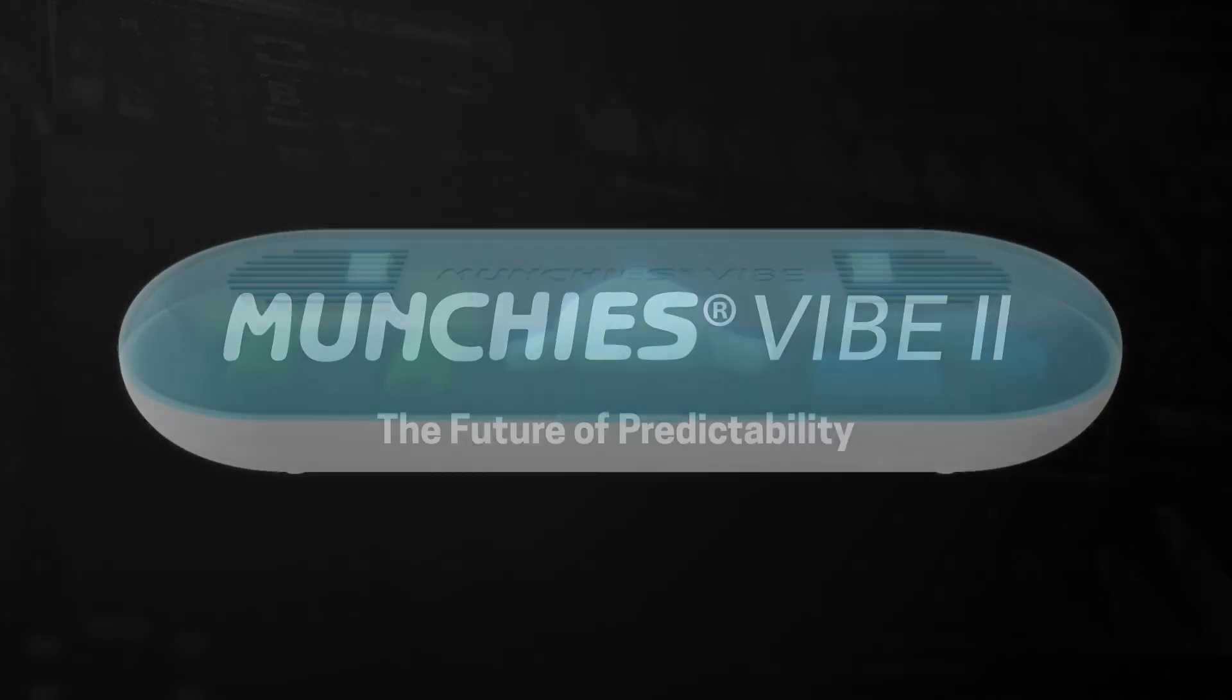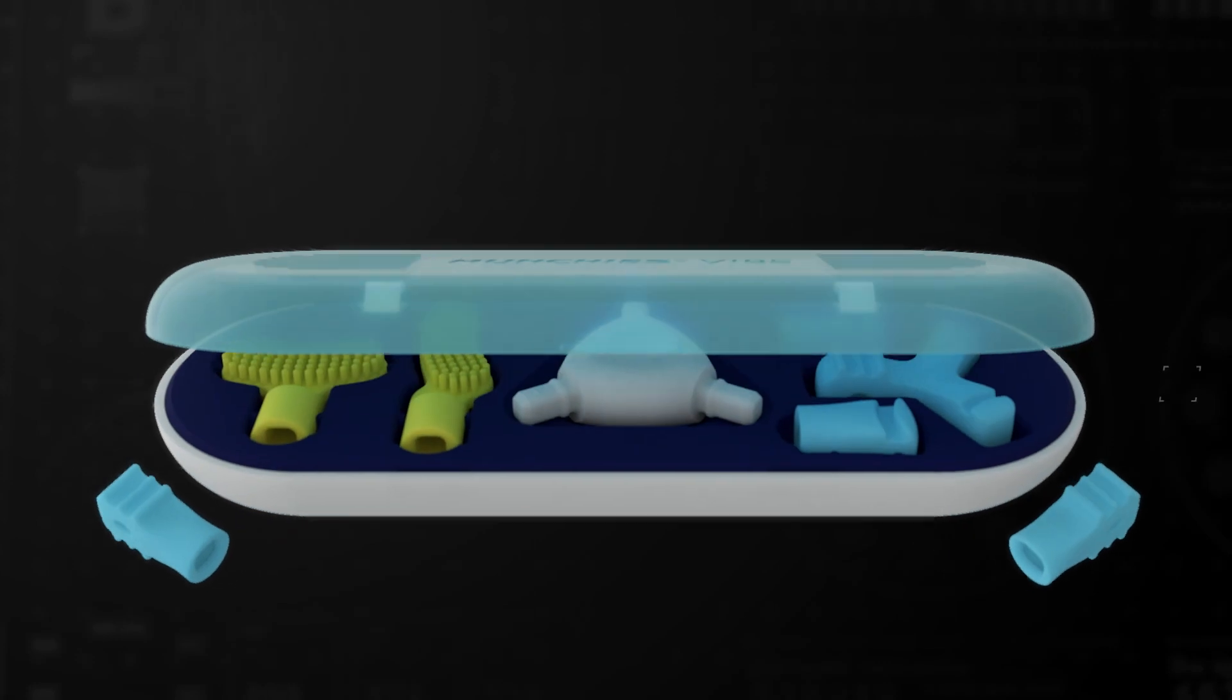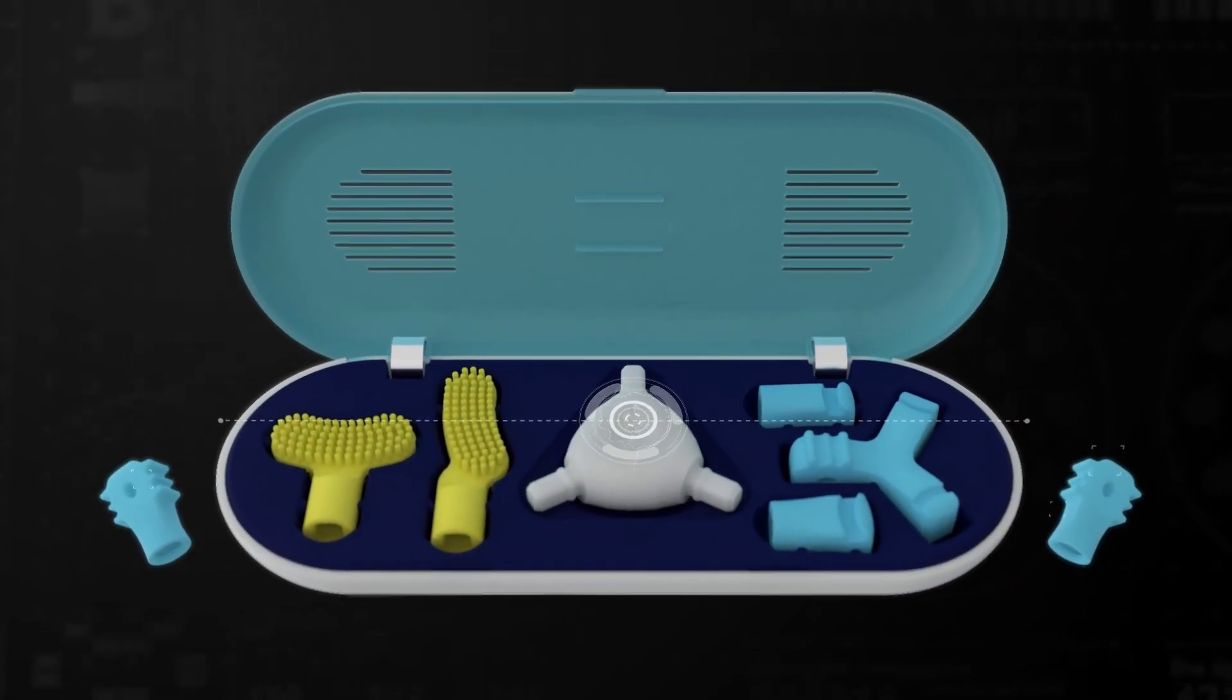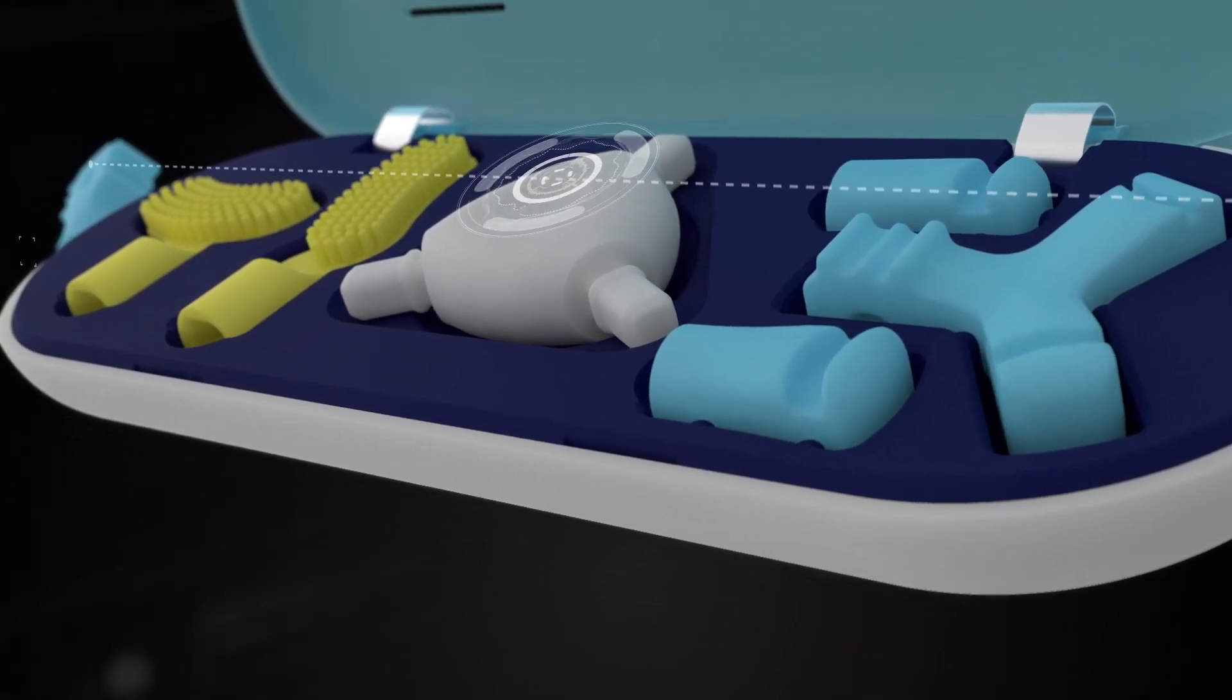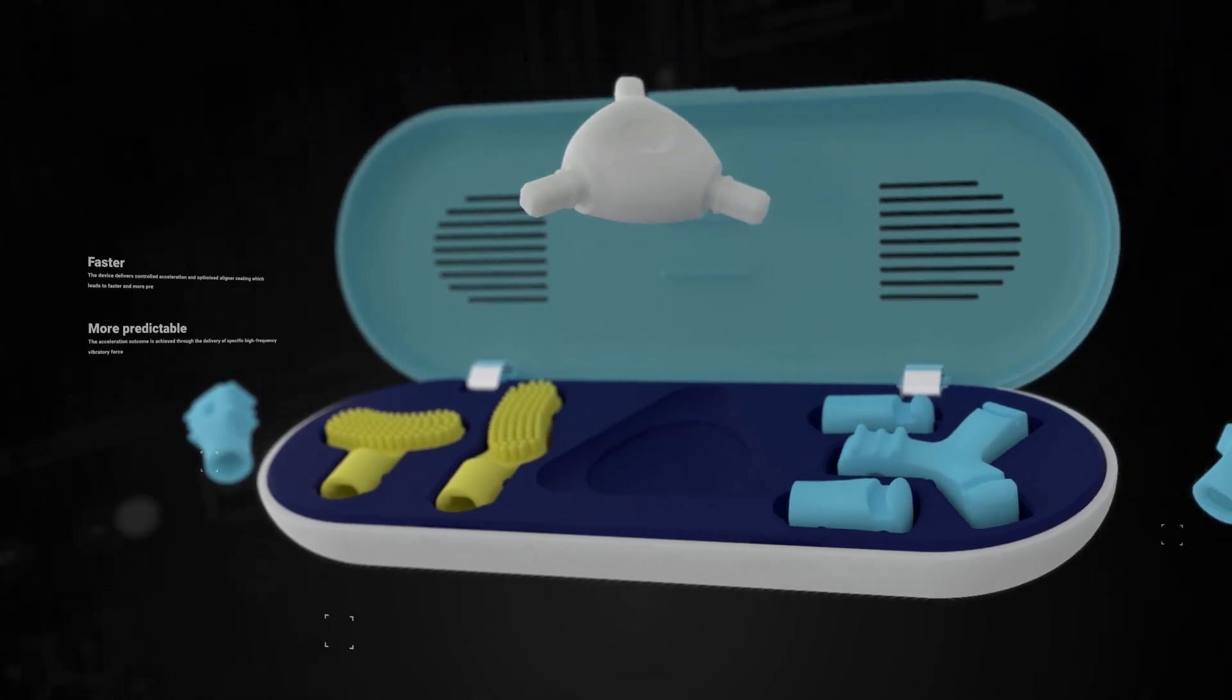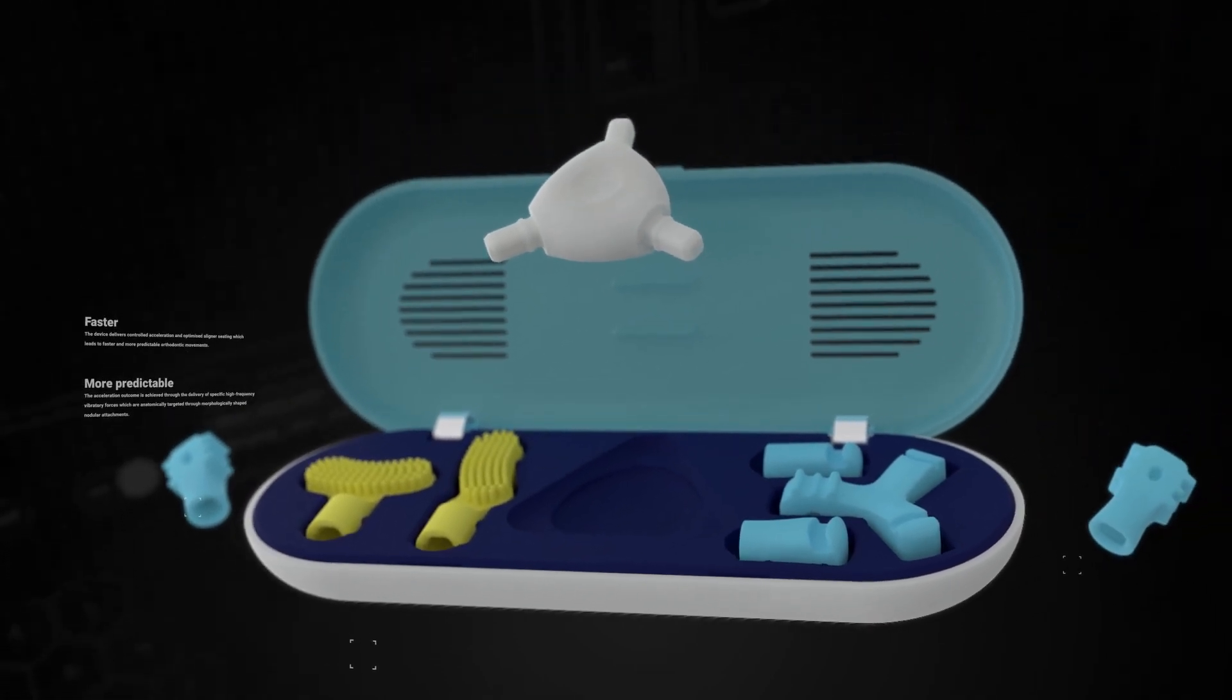Munchies Vibe 2 has been further enhanced to rewrite the future of predictability in clear aligner therapy treatment. The device delivers controlled acceleration and optimized aligner seating which leads to faster and more predictable orthodontic movements.